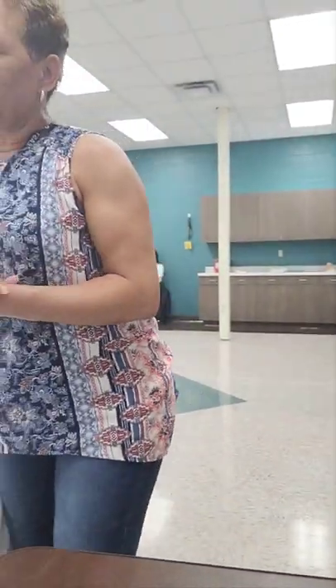Mrs. Jones, I'm going to go wash my hands and gather my supplies. Is there anything I can do for you before I leave? All right, I'll be right back. Washing hands now. For Pearson Vue and Credentia, at the test sites your supplies will be stored either in a foul cabinet, on a bookshelf, or somewhere in the skills testing room, or on a table.